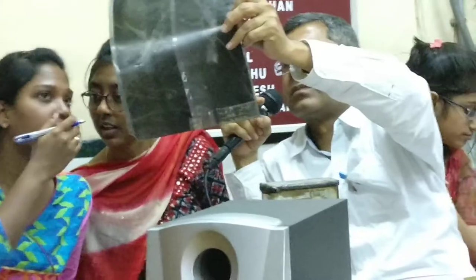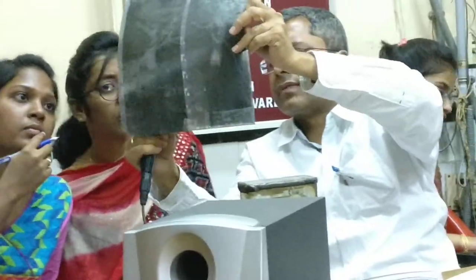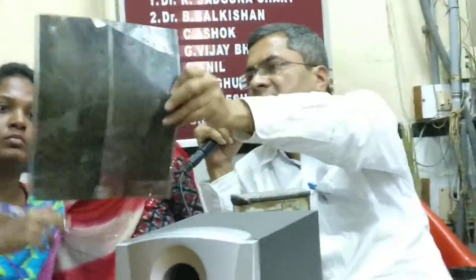T for? Okay, so it is an outside T-tube. So where you put a T-tube, what are the indications for a T-tube? They will ask you. Choledochotomy, opening of the common bile duct for stone disease.